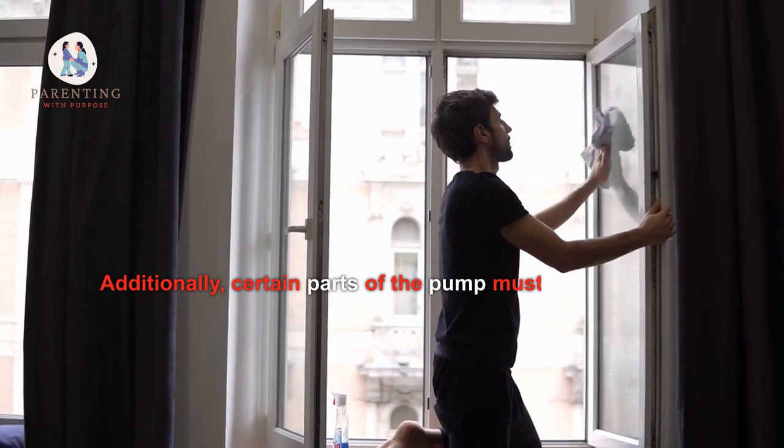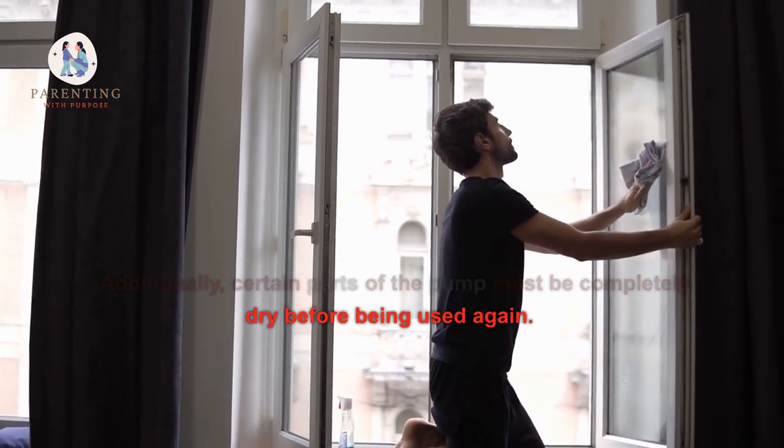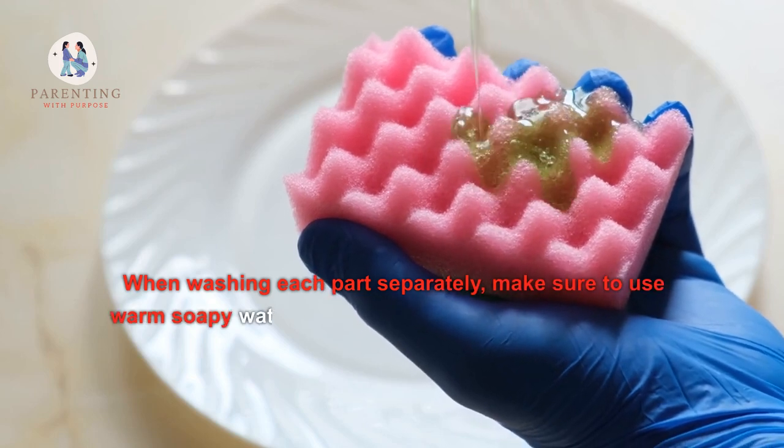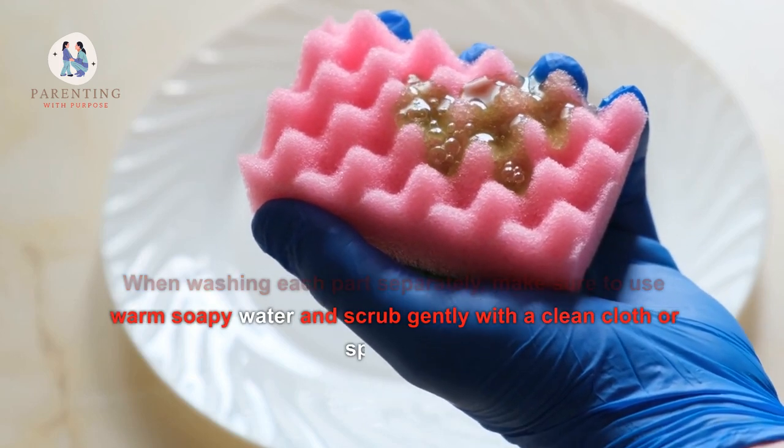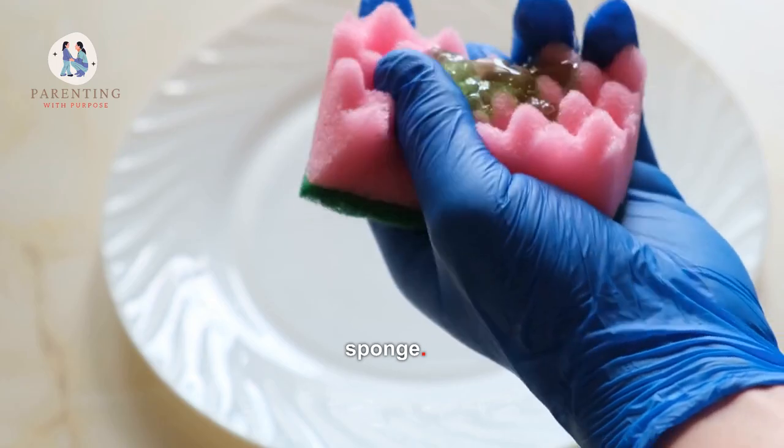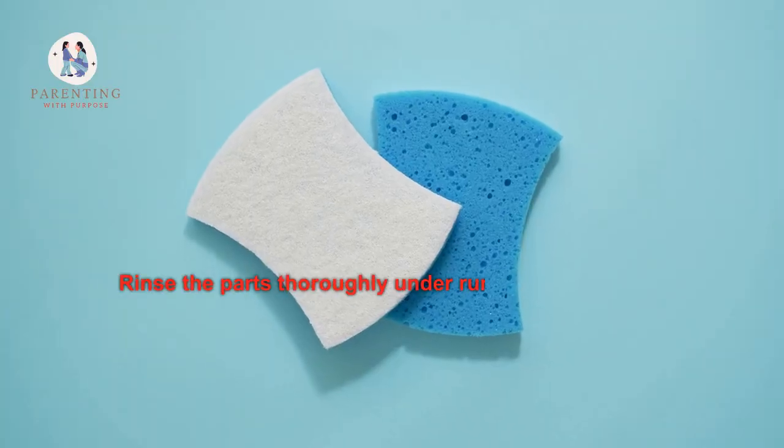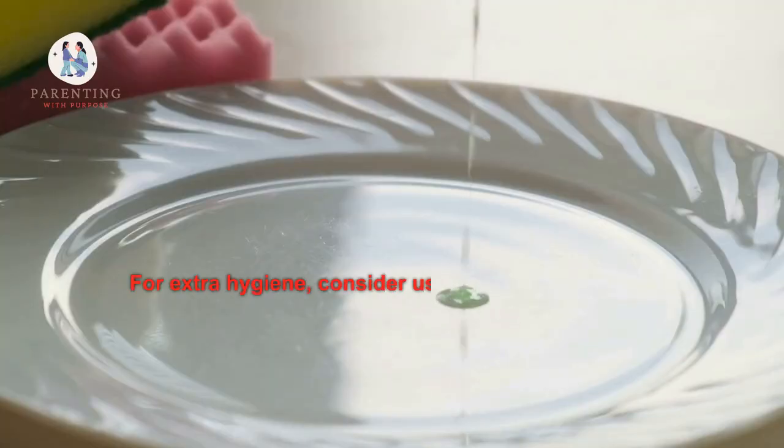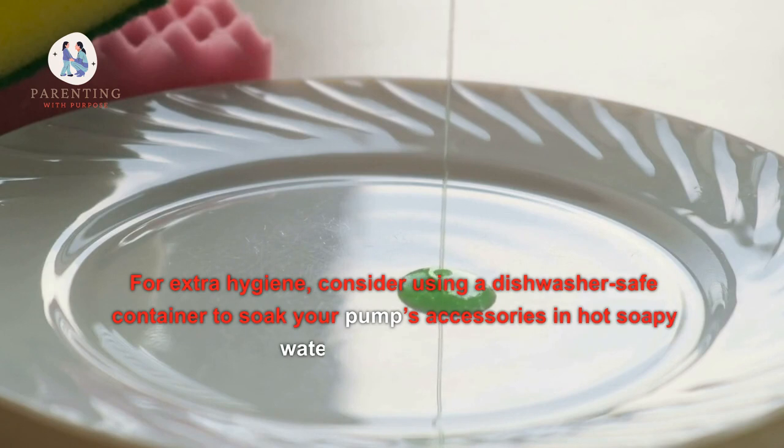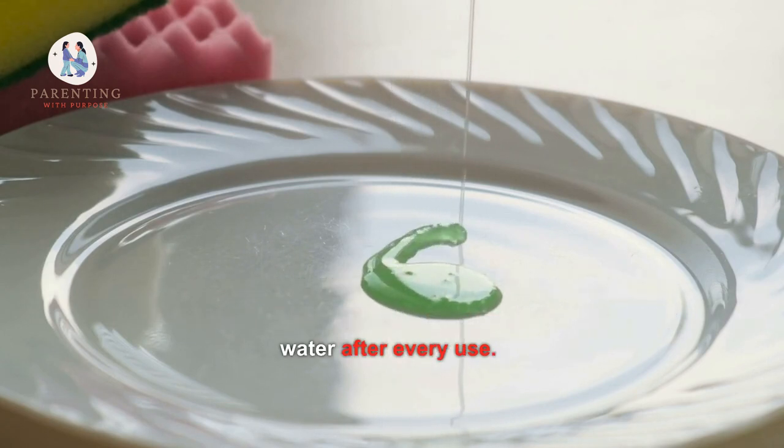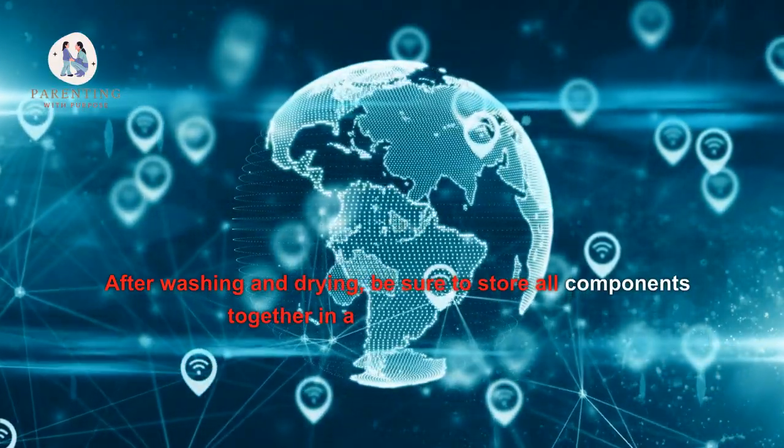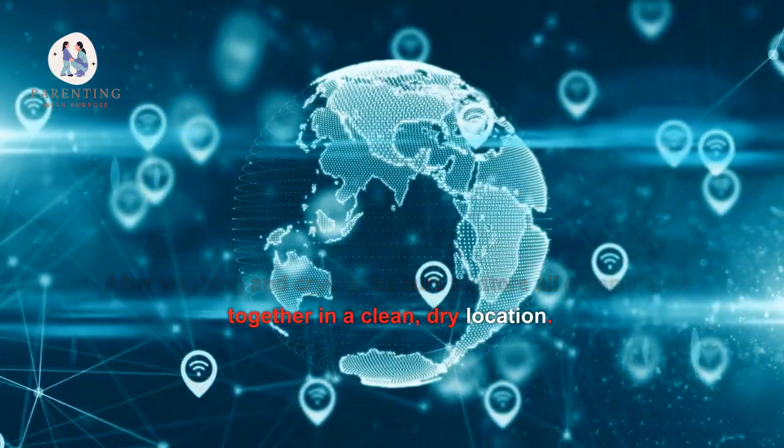Additionally, certain parts of the pump must be completely dry before being used again. When washing each part separately, make sure to use warm soapy water and scrub gently with a clean cloth or sponge. Rinse the parts thoroughly under running water before air drying them on a clean surface. For extra hygiene, consider using a dishwasher-safe container to soak your pump's accessories in hot soapy water after every use. After washing and drying, be sure to store all components together in a clean, dry location.